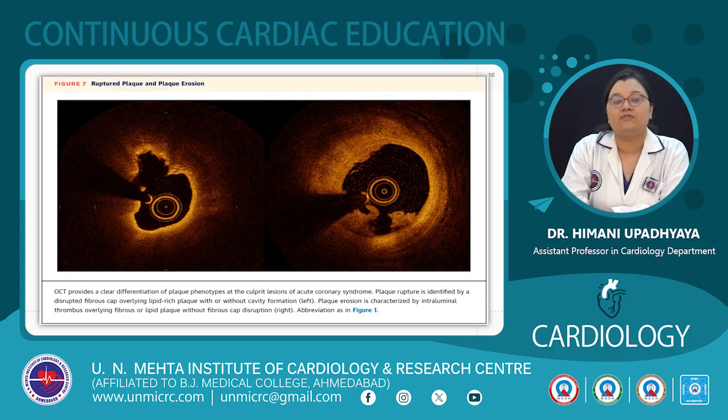OCT can also very well differentiate between plaque rupture and plaque erosion. If there is fibrous cap disruption with or without cavity formation, we can say that is a plaque rupture. In case of plaque erosion, there is intraluminal thrombus overlying fibrous or lipid plaque without fibrous cap disruption, which is seen in the second image.